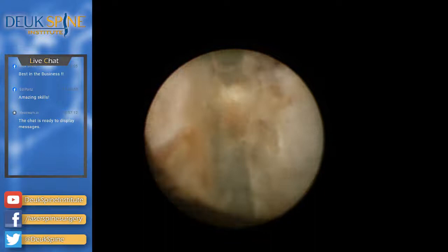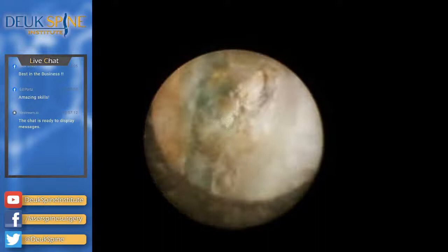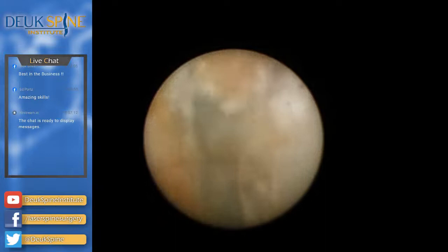And you have to be just real careful. I used to damage them more frequently because I was a little more aggressive with pulling and pushing. But now I learned to put my pulling and pushing actually on the tube, the metal tube, rather than on the shaft of the scope.